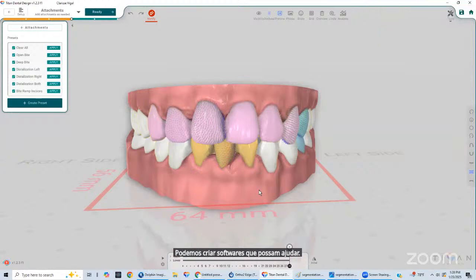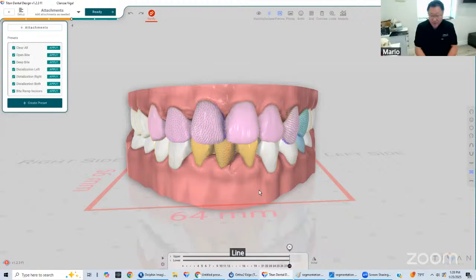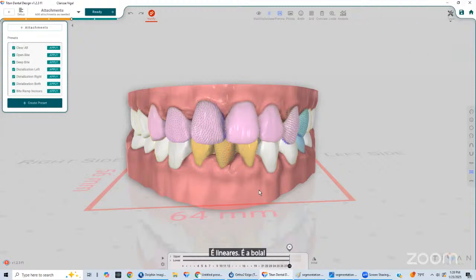One final comment, Frank, because I'm so excited to have you for the first time and talking to you. One thing that in my opinion is very important: we have the software, no problem. The software is one of the best that has been built for aligners. Thank you. The next one is the plastic, and the next one is the bone. Let's pretend that plastic is good. So we have the software, we have the plastic, but if we don't have bone, there is nothing we can do with the bone, with the root.